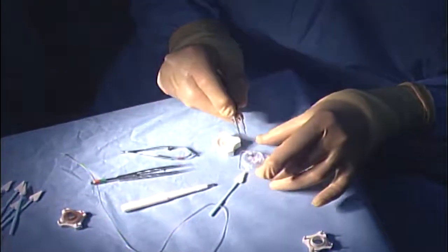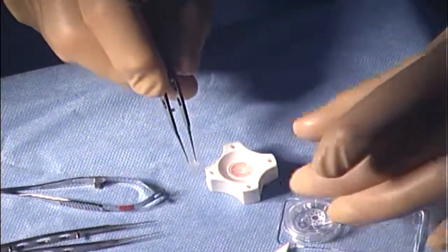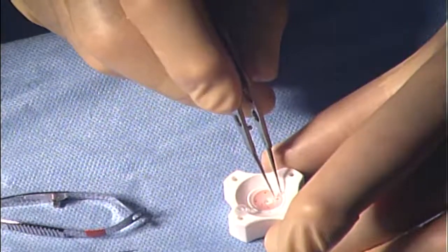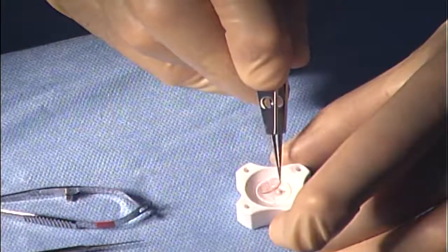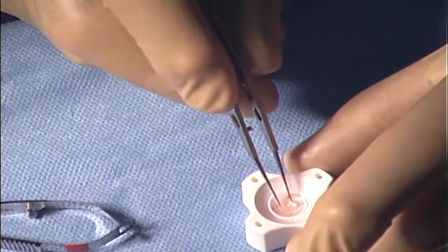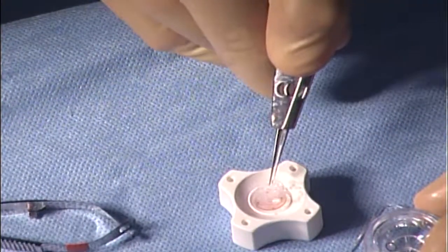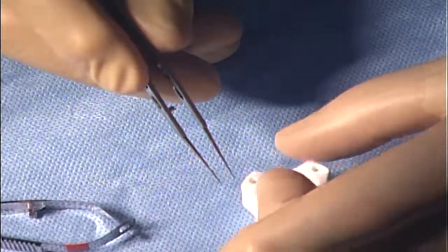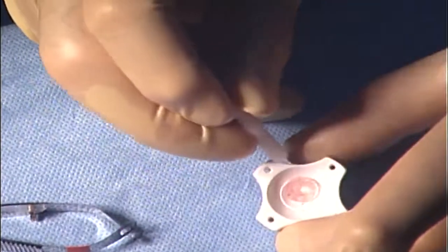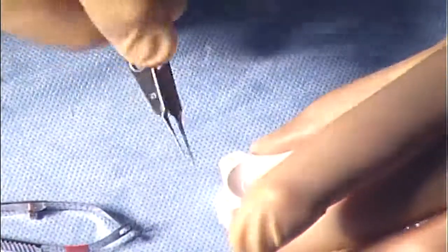The keratoprosthesis is in 3 parts. A central optic, which you see here, and the carrier cornea fits over the column of the optic, like so. And then over the back is the posterior plate. And we have a small wrench that puts that unit together. So there you can see the unit put together like so.